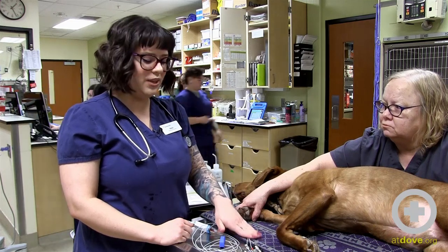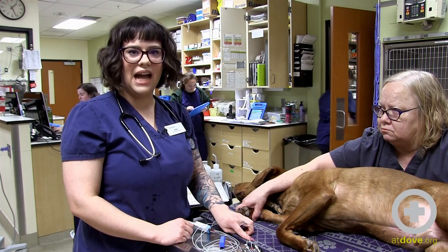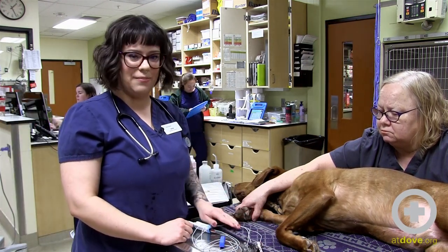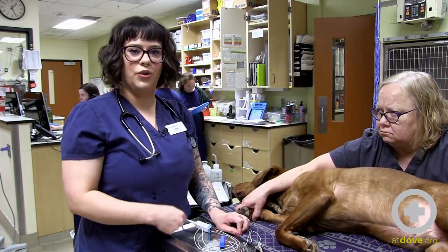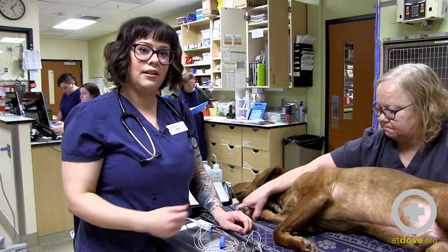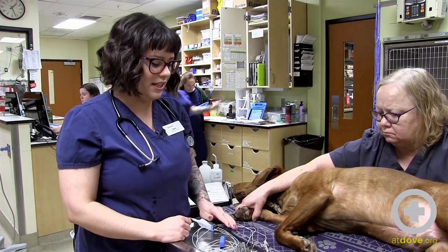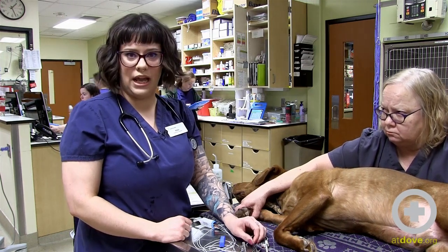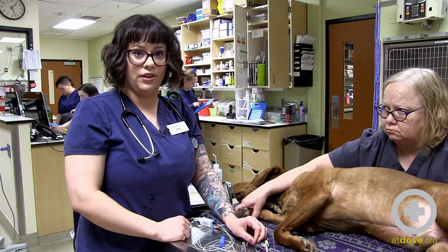I'm going to show you how to do this with our three-lead system. Our colors are white, black, and red. I've already applied some ultrasound gel to each clip — that's my preferred way to do it. Rather than using alcohol alone, the ultrasound gel can really help with connection and getting a really nice, clear ECG. So we're going to go ahead and apply these leads to each limb.